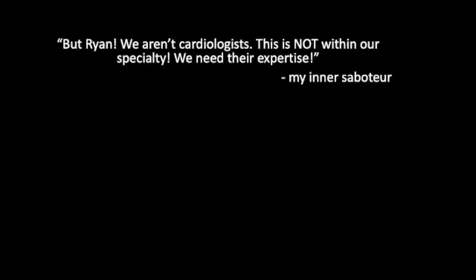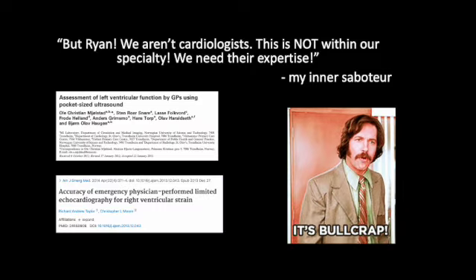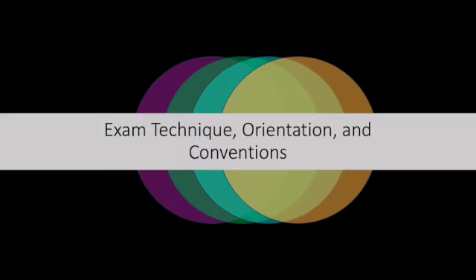Understanding the differences between formal and point-of-care studies helped me learn how to advocate when to perform an exam, but also know my limitations. It's an essential skill to learn. That being said, there's a good amount of high-quality evidence that supports non-cardiologist providers' use of POCUS. This helps them answer clinical questions, and a few of those articles are seen right here. Let's take a few minutes to go over the basics of a cardiac exam using point-of-care ultrasound.